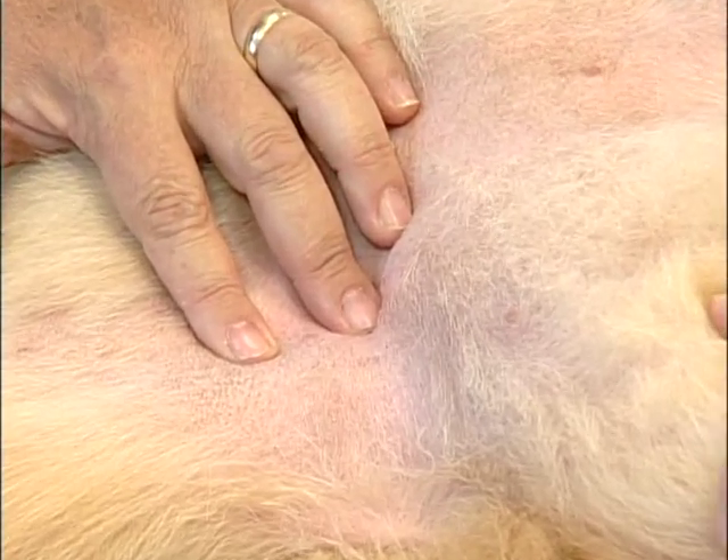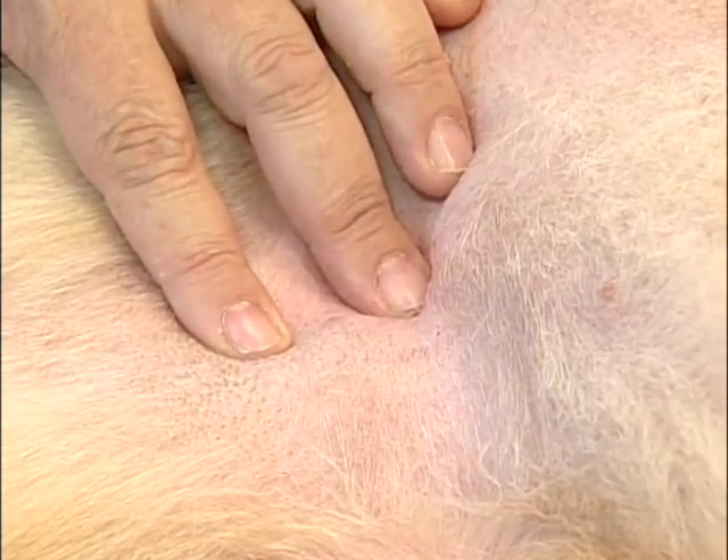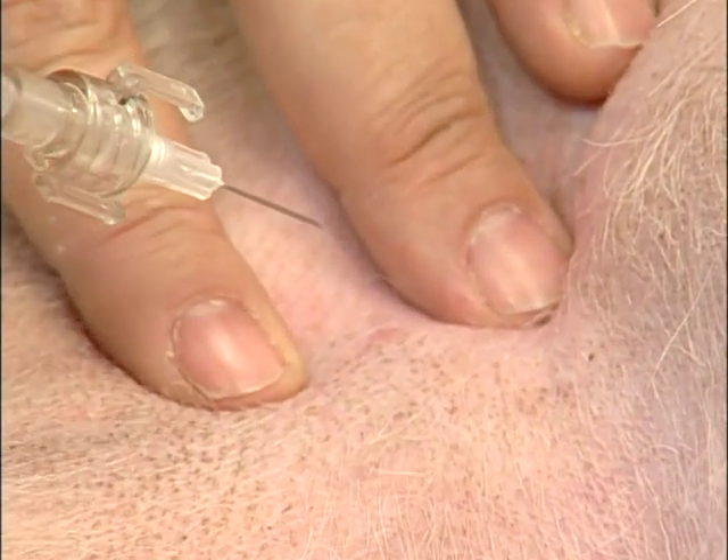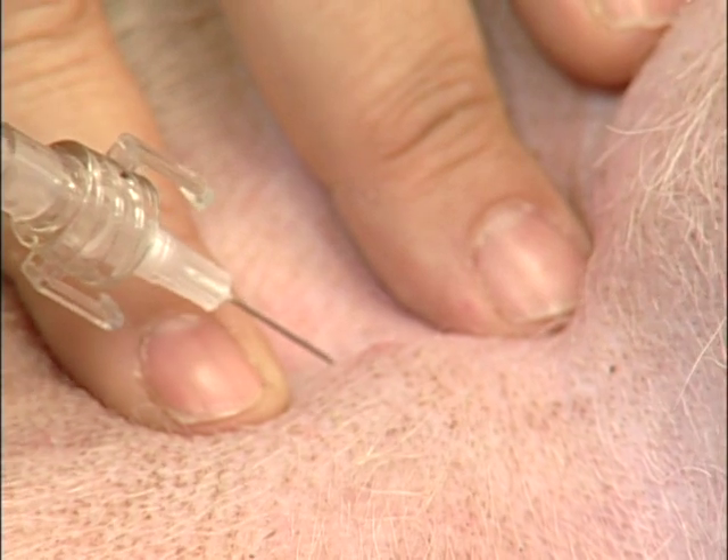And I think you can see on this dog, you actually can see the artery pulsing between my fingers. I'm going to take my blood gas syringe and gently insert it into that artery.